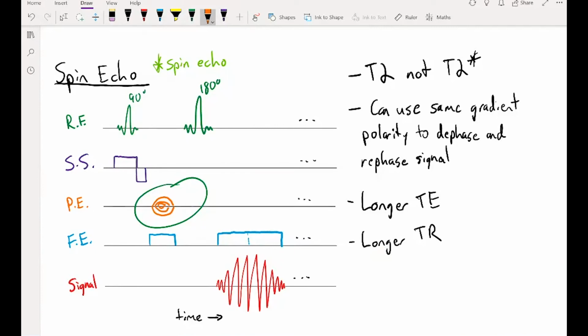But intuitively, k-space can be confusing, as we may see. Intuitively, the reason that we have to collect signal from the brain in different phase conditions is because it's difficult to tell the difference between signals at different phases and signals at different frequencies.